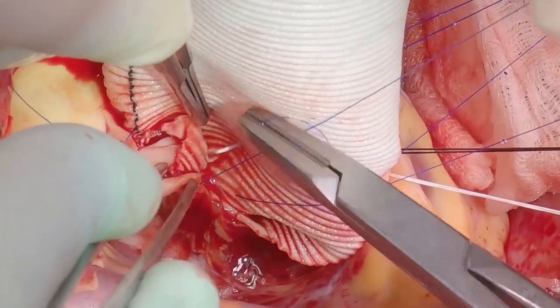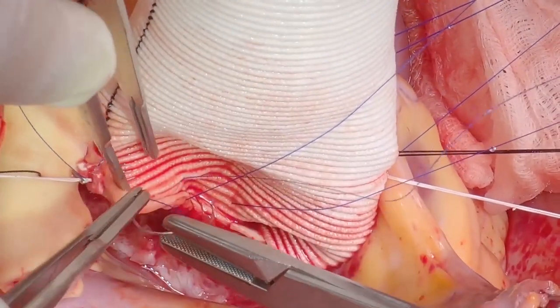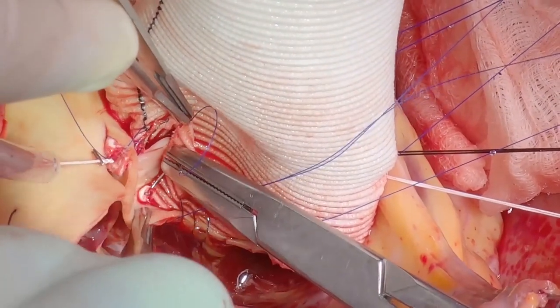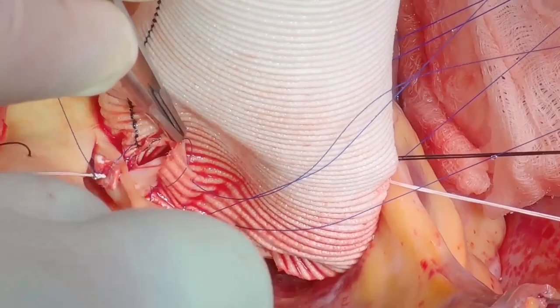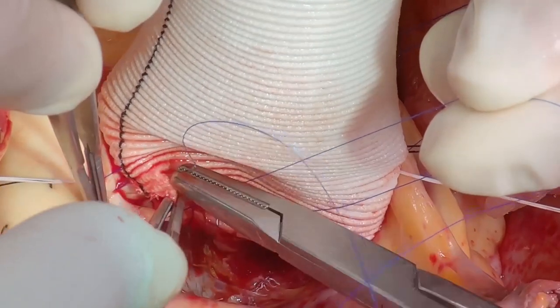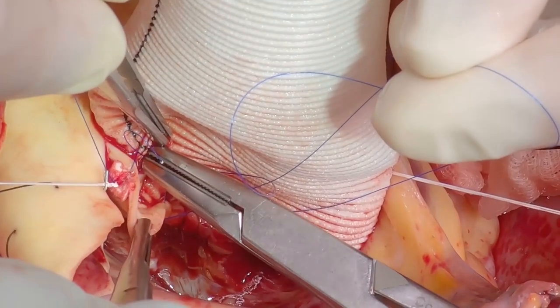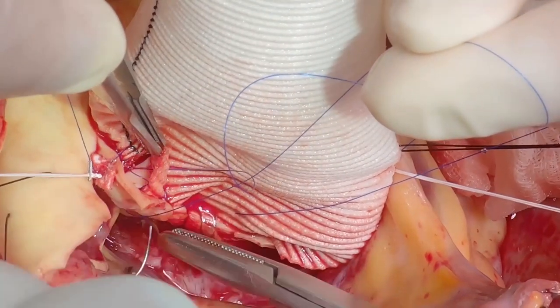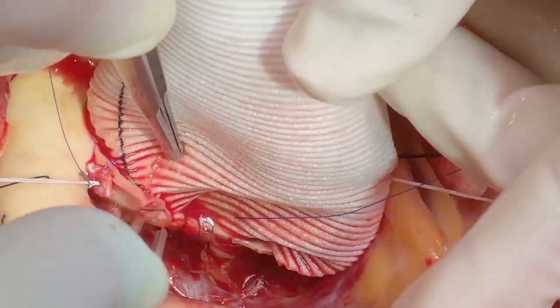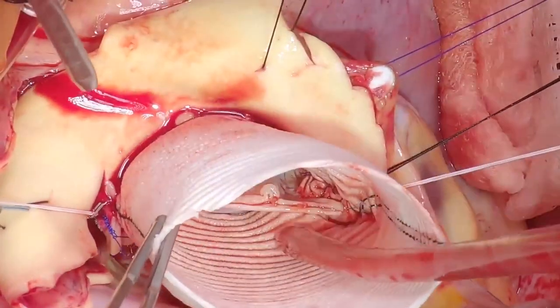The tension on the annulus is taken up by the graft and then by the Cabrol sutures. Where I've seen remodeling operations fail is at the commissures — so it's important to close this off so it's not a potential site for later stretching. Tie off those two sutures at the apex of the commissures.